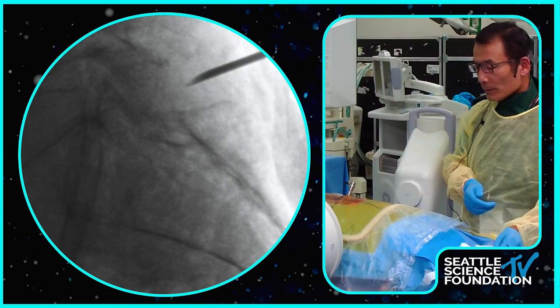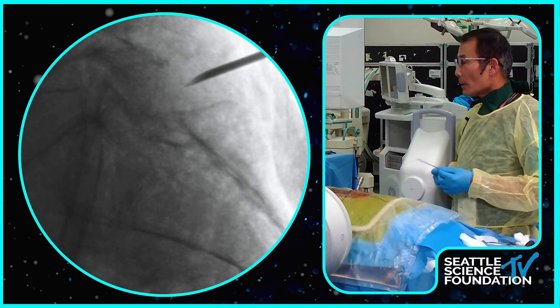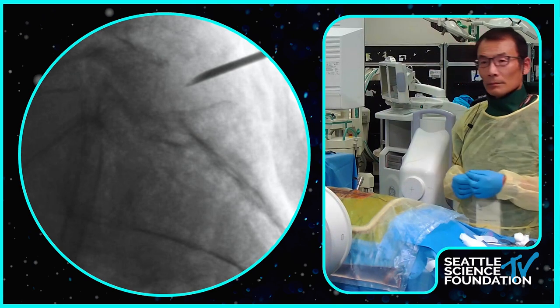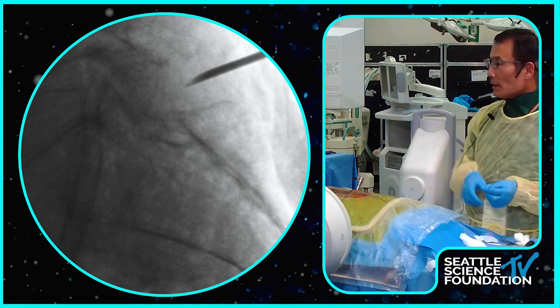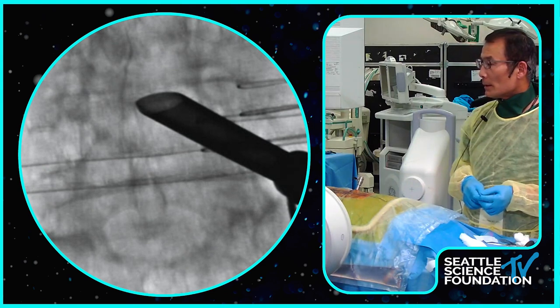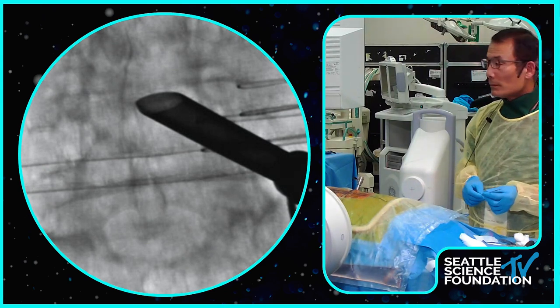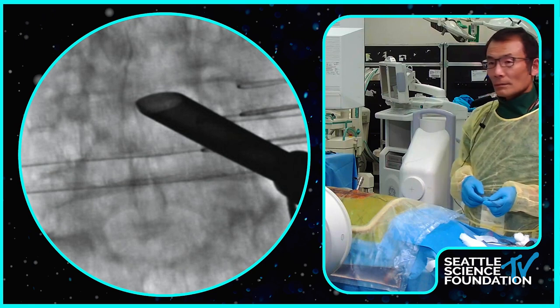Shen, can you again, I think we might have missed the AP starting point for where you were. I know you're just lateral facet. Just lateral facet, okay. Can we have an X-ray to show that, just so everyone can see? Can you show the other X-ray? The AP X-ray? Ben, can you move the image so we can look a little bit lower on that?